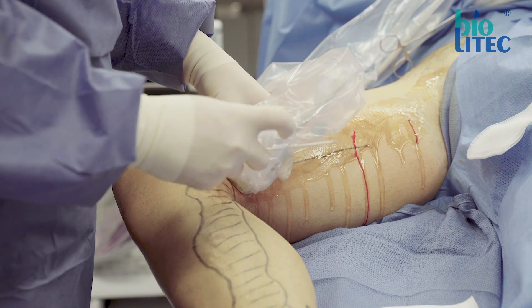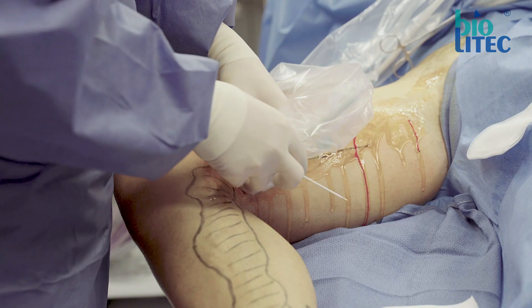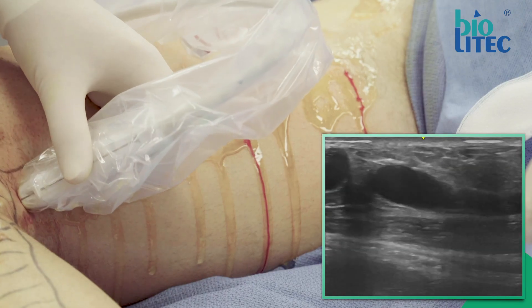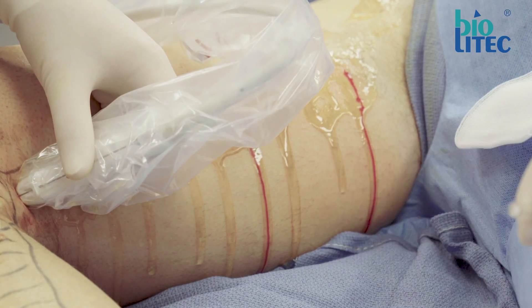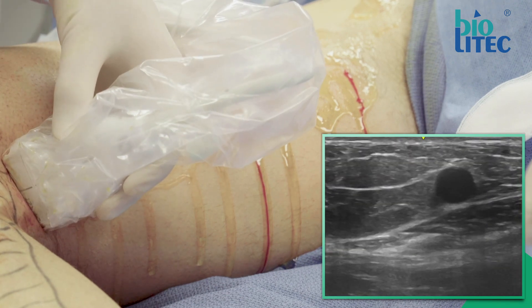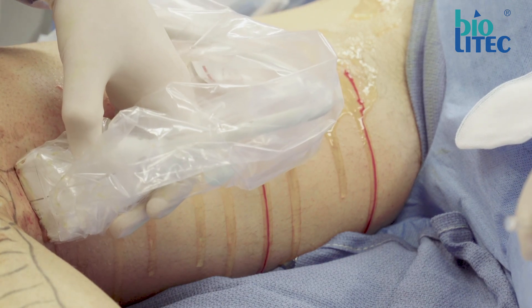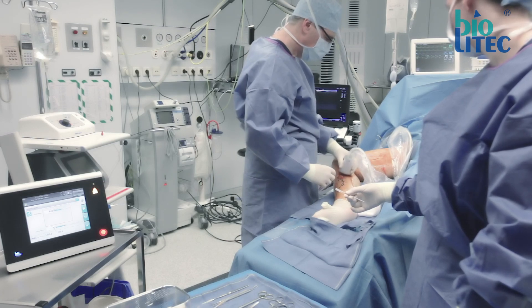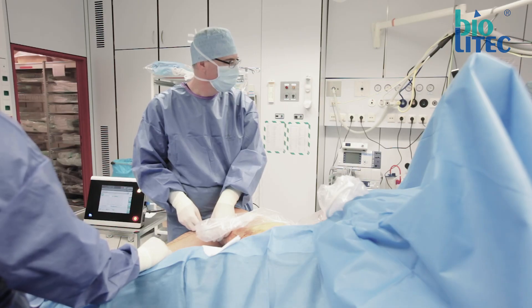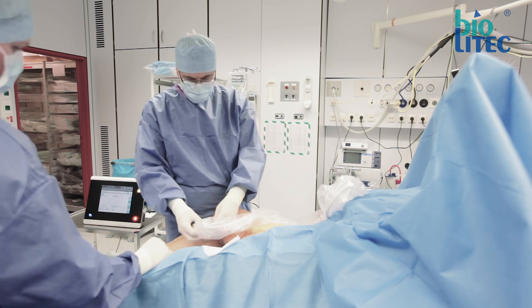Once you have determined the site of access, you have to aim. Put yourself in a comfortable position — take a seat, because being relaxed will help you. I prefer working out of plane instead of in plane. Often the vein starts moving a little when you approach it with the needle, and by working out of plane you will keep the vein in view at any given moment. Let your hand rest on the patient for stability, and avoid excessive compression of the vein. By compressing the vein proximal to the puncture site you cause some extra venous dilatation.